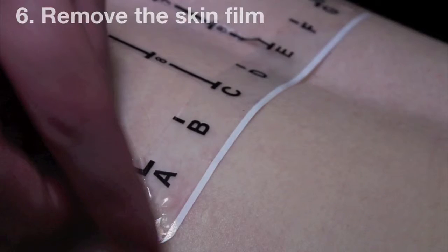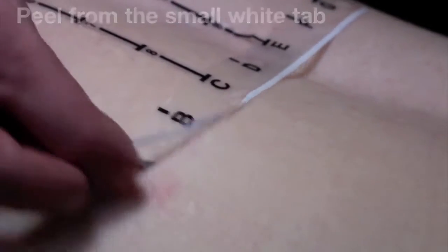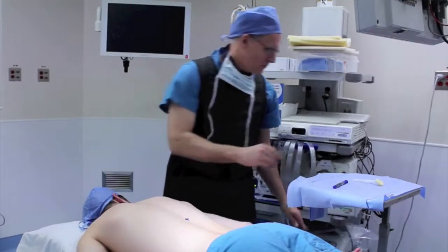Remove the skin film by peeling away the thin white tab. Clean and prep the skin and perform the incision.